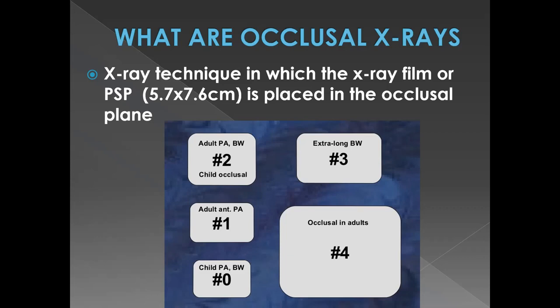In that, I talked about the different types of X-ray films or receptors that we have. Basically, you have the films which are developed via chemical processing and which are usually available in our dental colleges, hospitals, and even clinics. But nowadays, the trend is gradually shifting towards digital films or digital receptors, in which you can take an X-ray and just view it on your laptop.